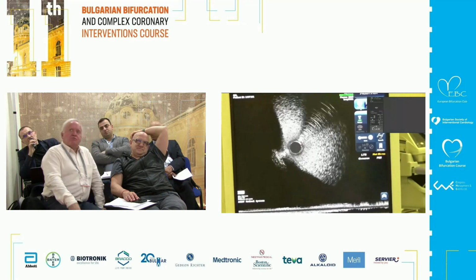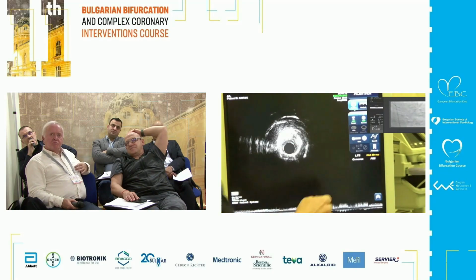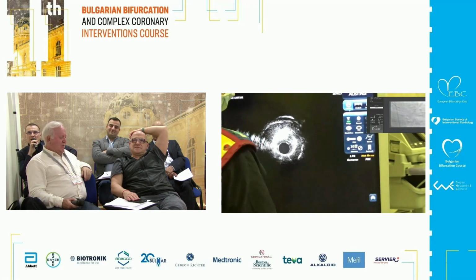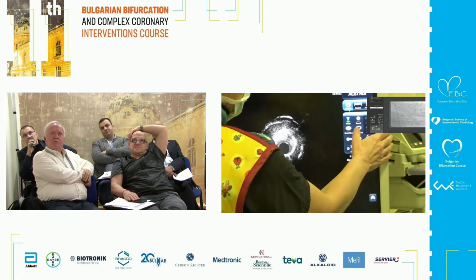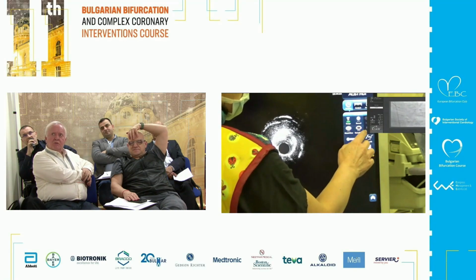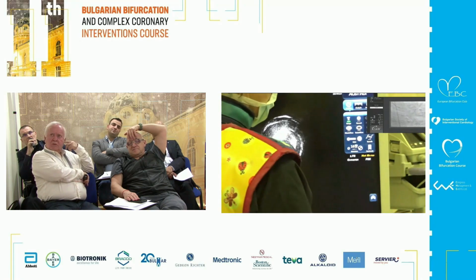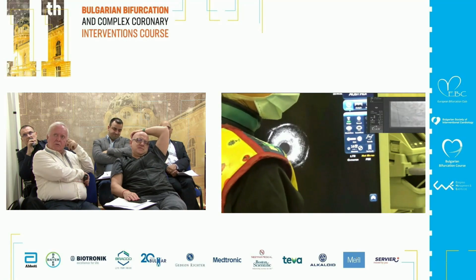I personally would not. You can stop the record now. Okay. Yes, just pull back from the circumflex and just measure the minimal lumen area at the LAD ostium. Just before the bifurcation, there was some. Yes, just.